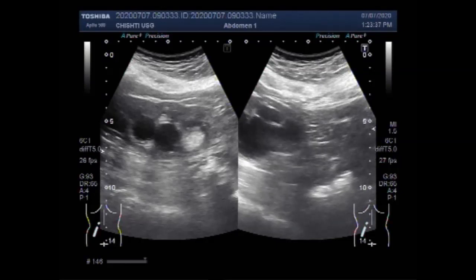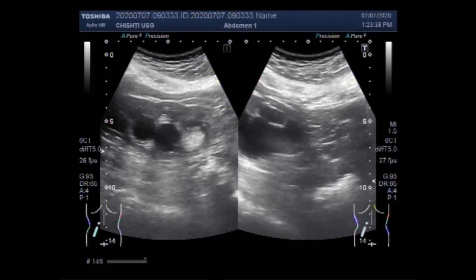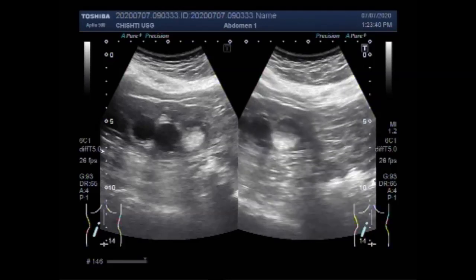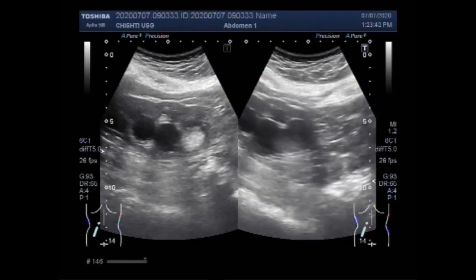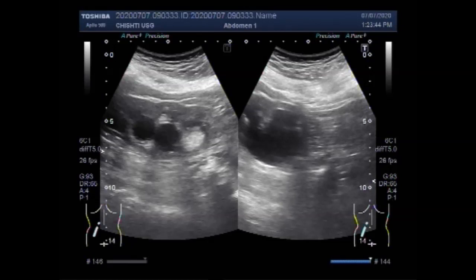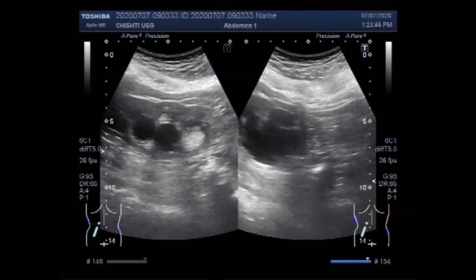If the patient is obese, the sonologist can get a better view in the supine position. This is the stone in the ureter.